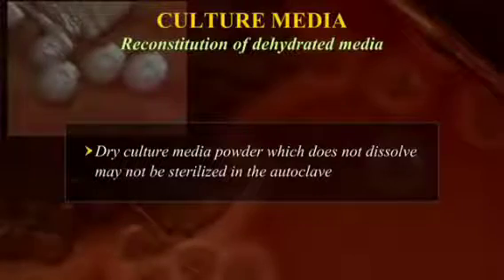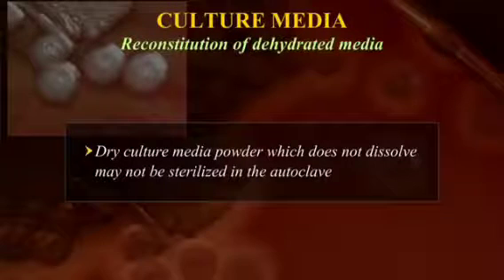This is important as dry culture media powder, which does not dissolve, may not be sterilized in the autoclave and can be a source of contamination.